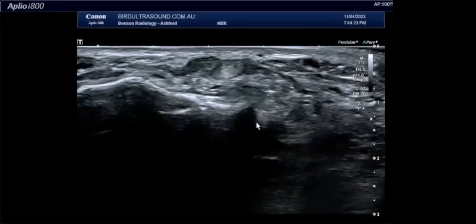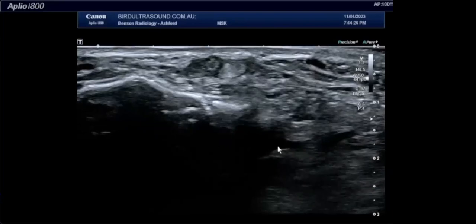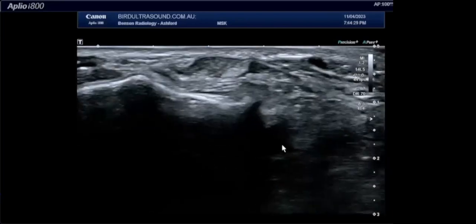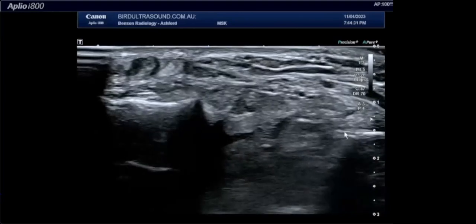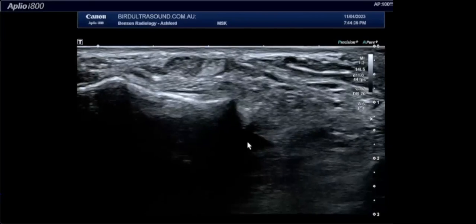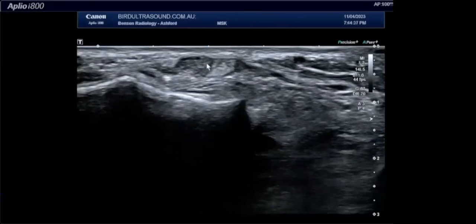And this is that little bit of fluid that I spoke about before, this little tiny drop of fluid here. It's monoloculated, it's a little bit compressible, and it's sitting in this back corner of the sinus tarsi. Here's the talus, here's the calcaneum, and that little bit of fluid there is just a tiny bit of fluid we've milked out of that subtalar joint.